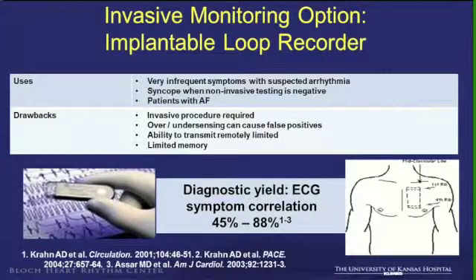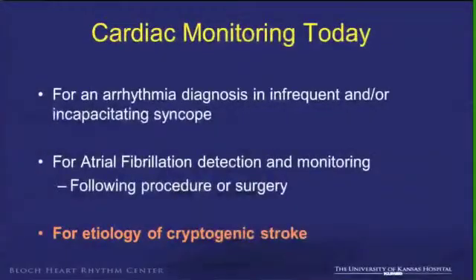A lot of times oversensing and undersensing can occur based on where you place the device subcutaneously. And the ability to transmit it remotely is limited. It's at this point still using a landline system.